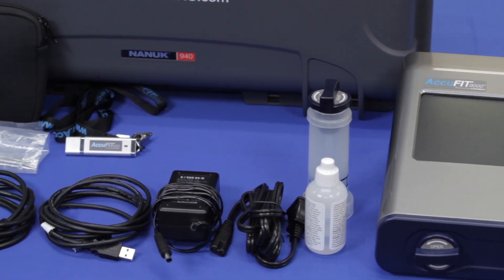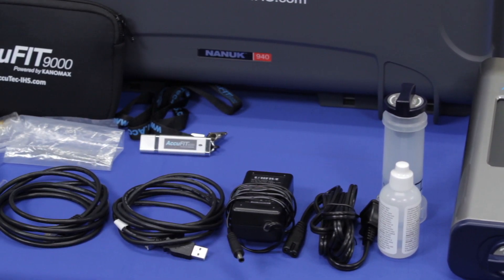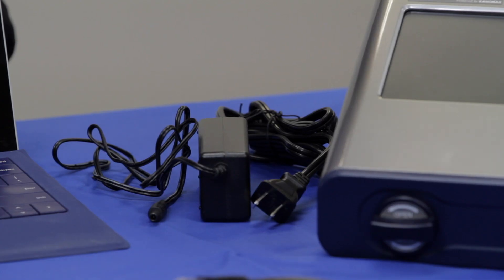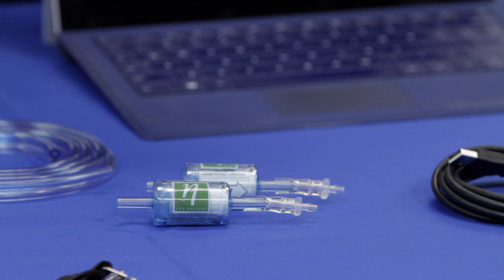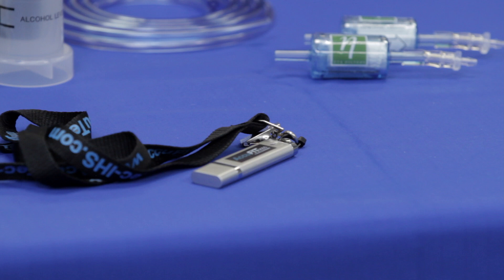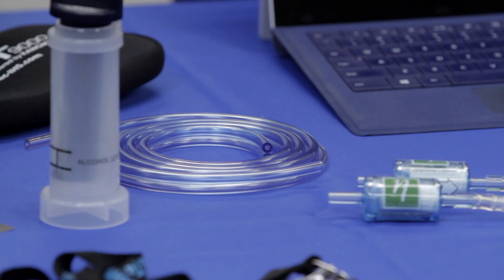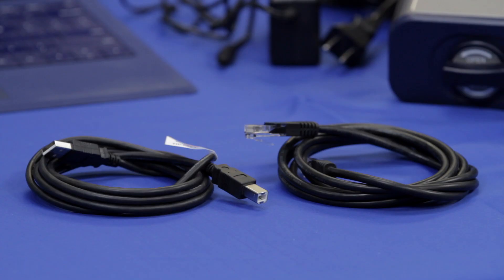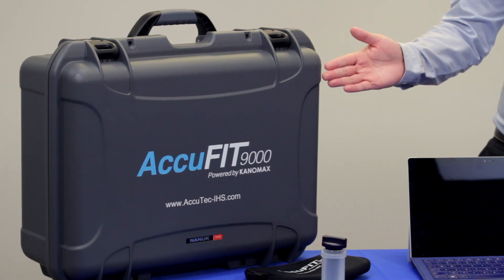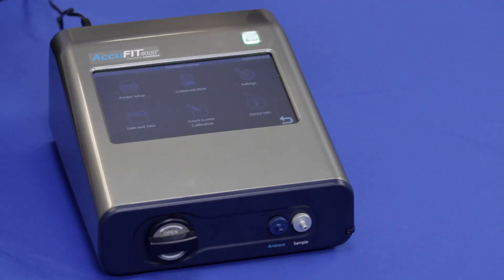The standard components included with the AccuFit respirator fit tester include an AC adapter and power cord, a zero filter, an alcohol cartridge, storage container and cap, a USB flash drive with software and manuals, a twin tube that connects the instrument to the respirator, computer cables, alcohol supplies, and a hard-sided carry case.